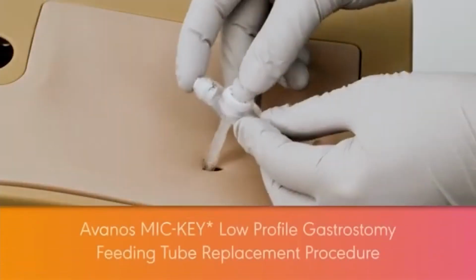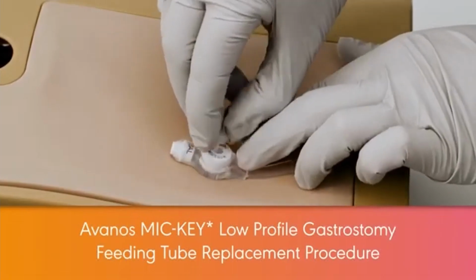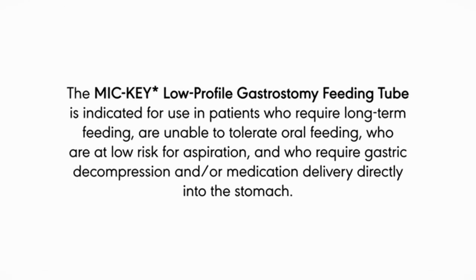This video demonstrates the replacement procedure for the AVANOS MIC KEY Low Profile Gastrostomy Feeding Tube Kit. The MIC KEY Low Profile Gastrostomy Feeding Tube is indicated for use in patients who require long-term feeding, are unable to tolerate oral feeding, who are at low risk for aspiration, and who require gastric decompression and/or medication delivery directly into the stomach.